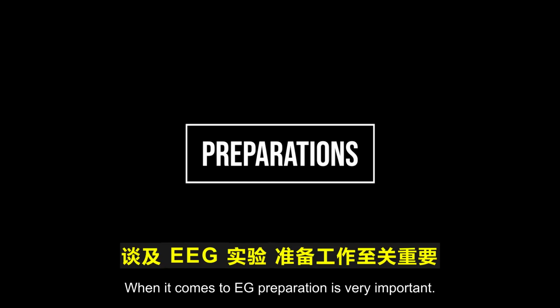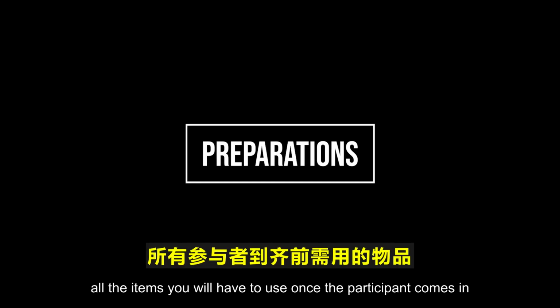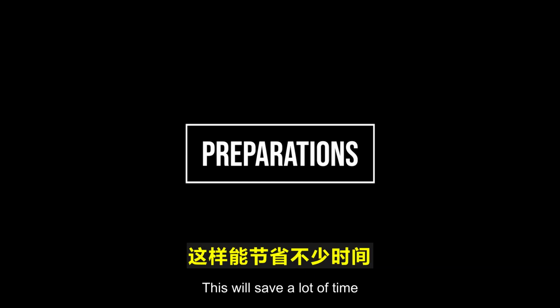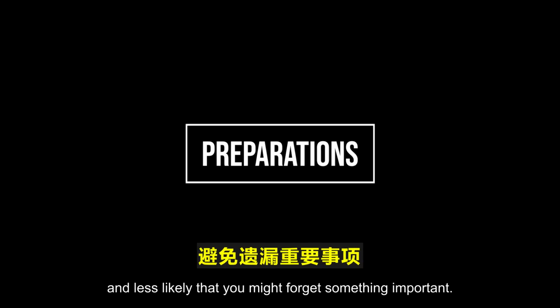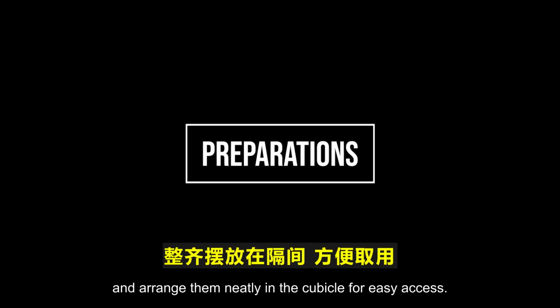When it comes to EEG, preparation is very important. You must make sure that all the items you will have to use once the participant comes in are ready well in advance. This will save a lot of time and awkwardness when the participant comes and will make it less stressful and less likely that you might forget something important. I usually gather all the items and arrange them neatly in the cubicle for easy access.